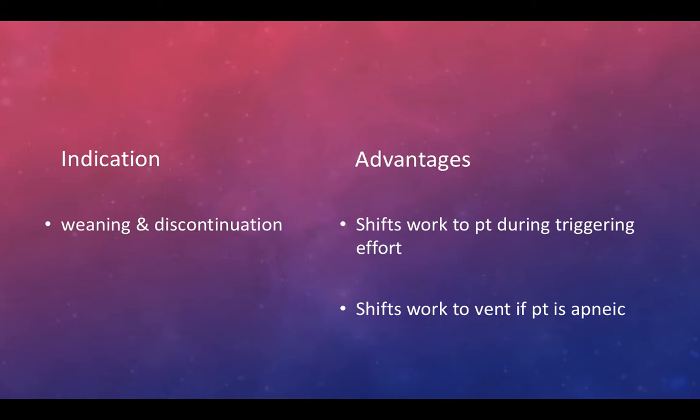Activation of the Automode feature is indicated for patients who are candidates for weaning and discontinuation of mechanical ventilation.